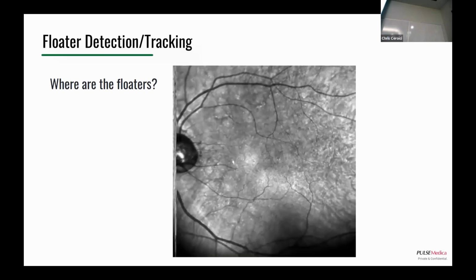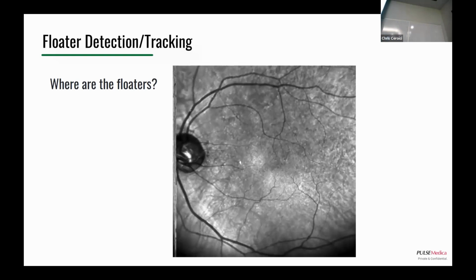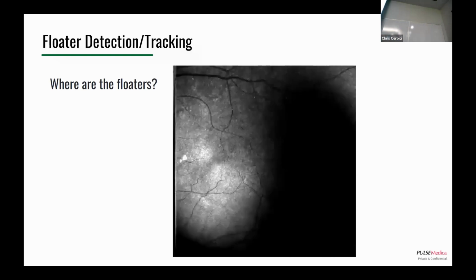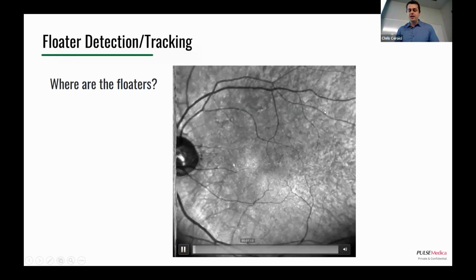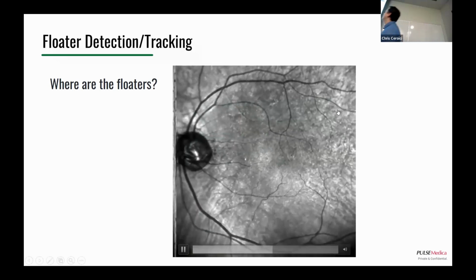What is that? This thing? That's just a reflection from the imaging system. Yeah, an artifact. So you can kind of see it floating near the top. It's blocked by that little talking head. I'll skip to the part where you can see it. I can. Thank you. There we go.